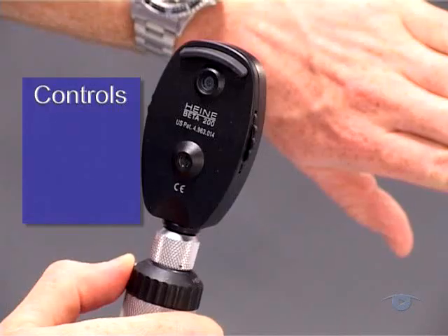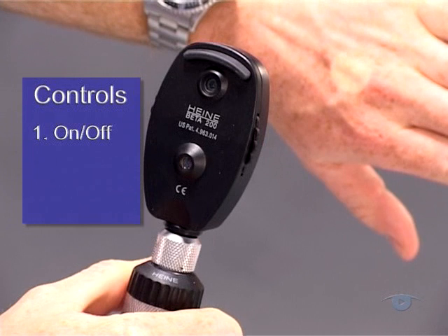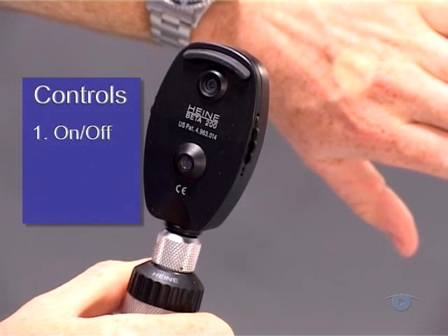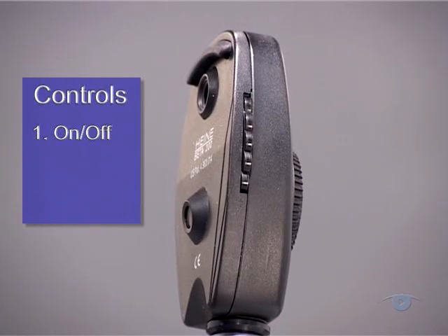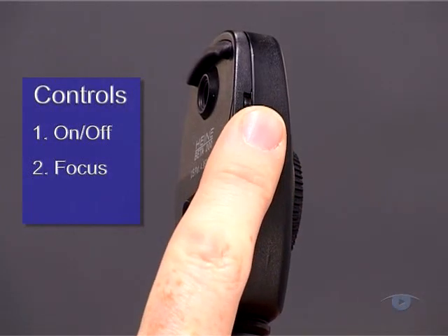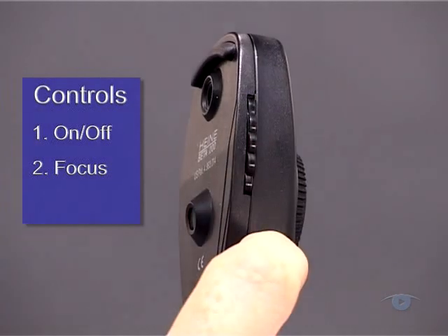There are three basic controls that are common to all modern ophthalmoscopes, regardless of their design. Firstly, there's an on-off switch, which also controls the brightness of the light and is usually found on the top of the handle. Secondly, a lens wheel which adjusts the focus. This is mounted in the head of the instrument and carries a graduated range of lens powers around its edge.